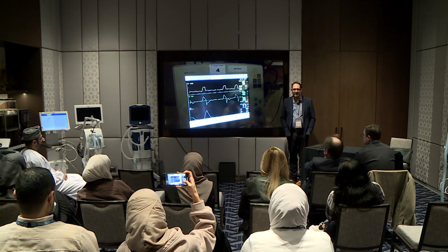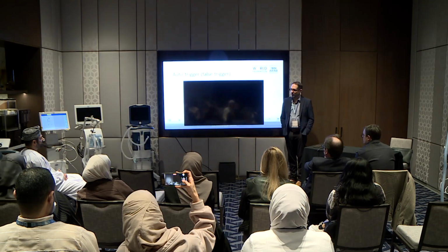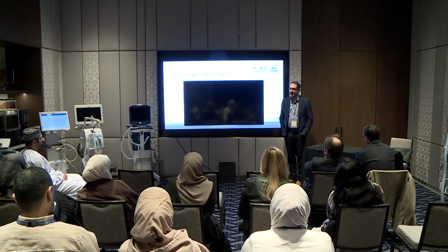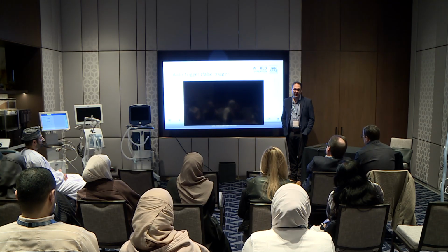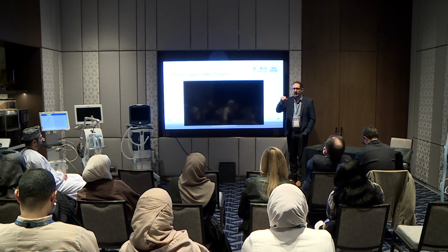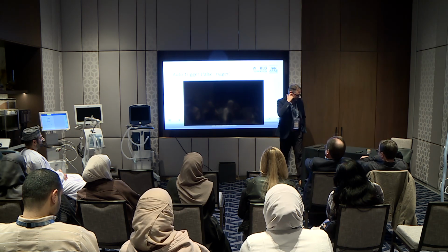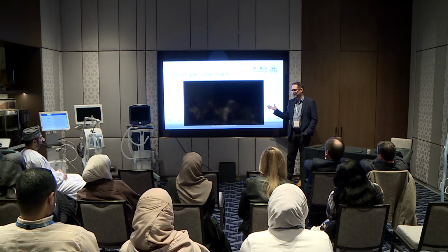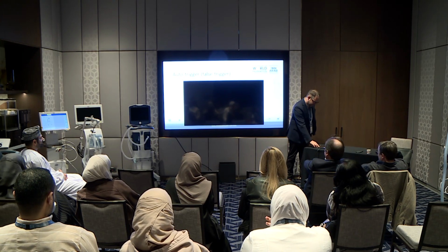So flow is a very, very sensitive trigger. I'm not saying don't use flow trigger. I'm saying if you have auto-cycling or you expect auto-cycling, changing it simply to a pressure trigger will usually resolve it. In that patient, just switching to the pressure trigger, the rate all of a sudden dropped, but it was now the patient actually triggering the ventilator. Because you obviously can't get rid of the cause, which is the patient's heart rate. I'm not going to stop their heart from beating. I don't want to, so I have to change the trigger.